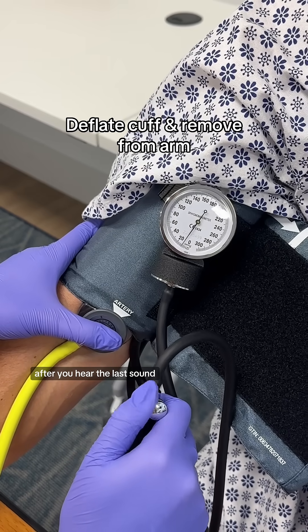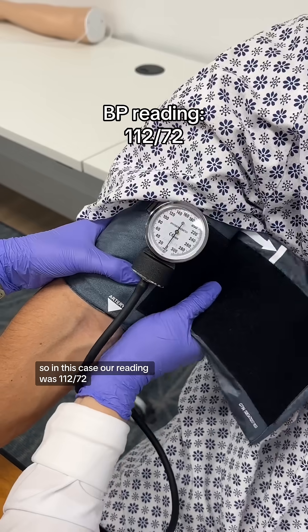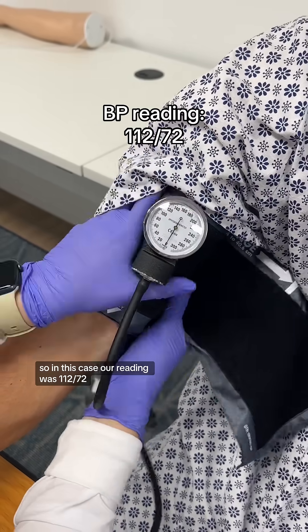After you hear the last sounds, you can completely deflate the cuff and remove it from the patient's arm. In this case, our reading was 112 over 72.